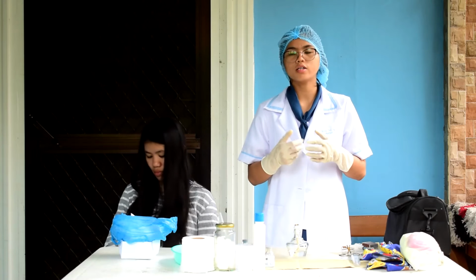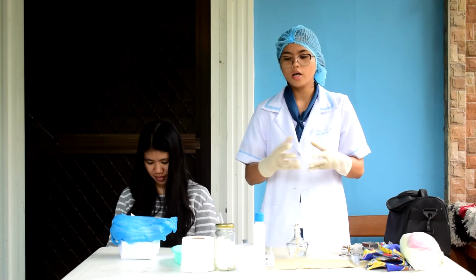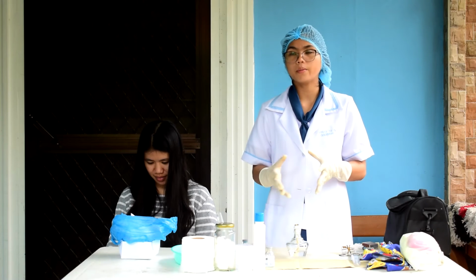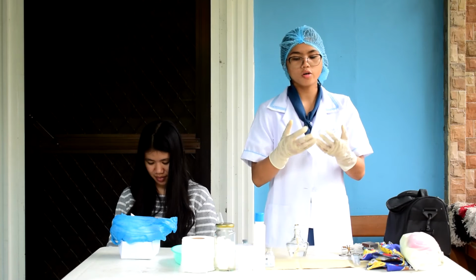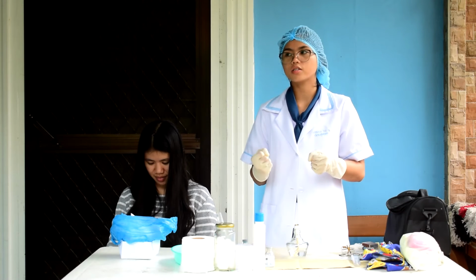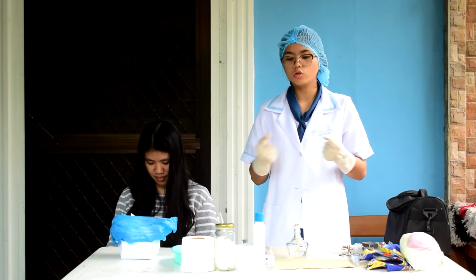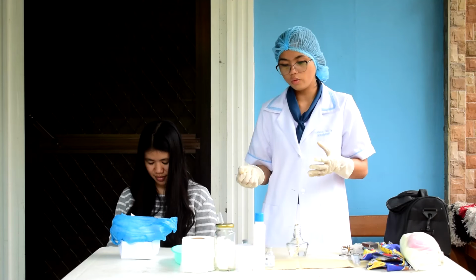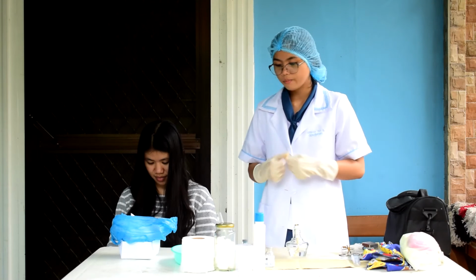For your acetic test, you will be needing your test tube, your 5% acetic acid, your syringe for your urine, and a syringe for the acetic acid. So what do you do? Let's start with the procedure explained to the mother.